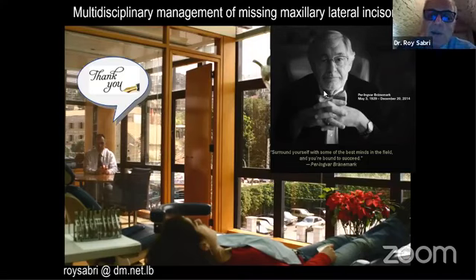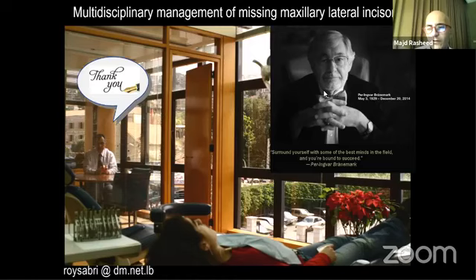So if there is initially a large diastema, it's better to put a fixed retainer on both centrals. You can also do a frenectomy if the diastema is too large, but if I want to do a frenectomy, I do it after space closure, not before.